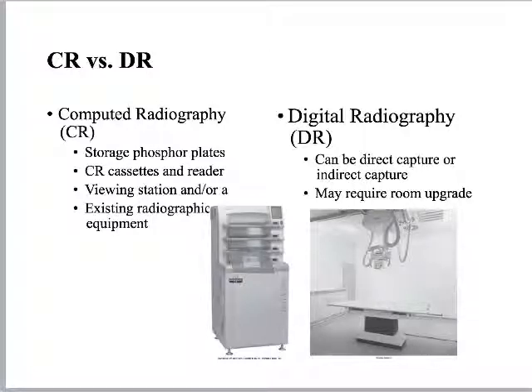And what I'm saying about CR is it made total sense to all these X-ray techs who used to work with film. Okay, this is just like film. We put the cassette in the thing, and instead of going into a dark room, it's nice, now we don't need a dark room. We'll just drop it into this reader. The reader will process it for us, right? So it was kind of a small sea change there.